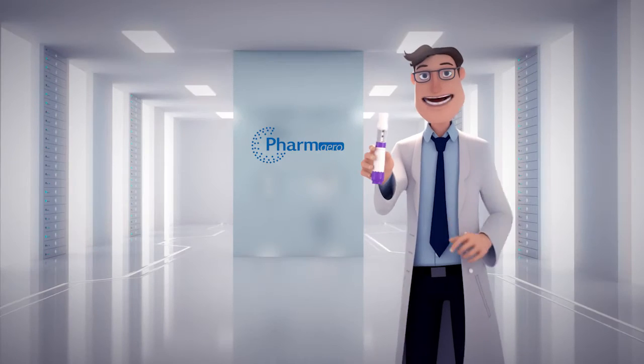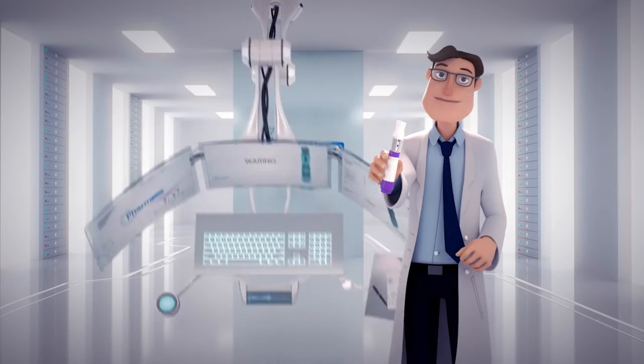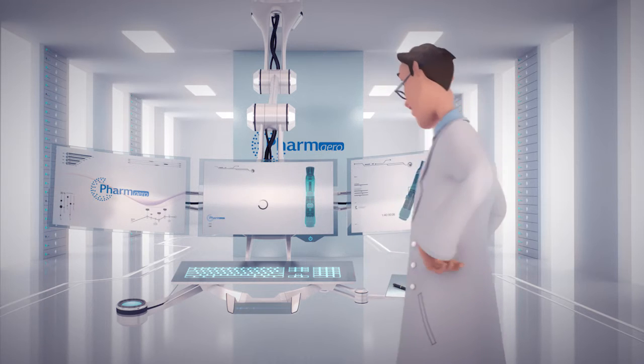And guess what? The ADI uses only 20% of the drug for the same result. Let's see how it works.